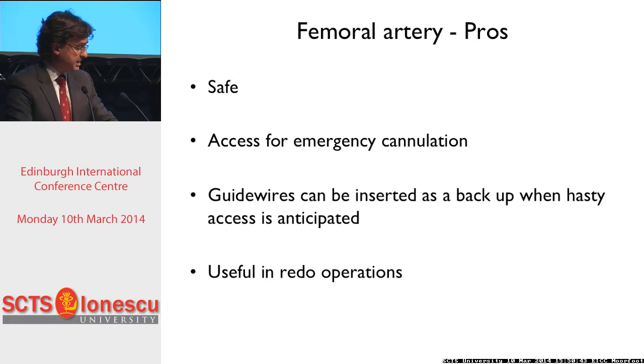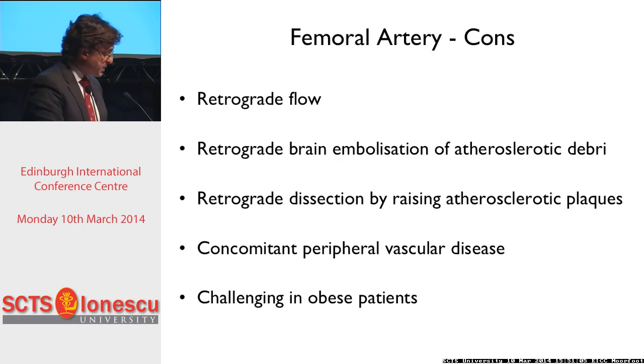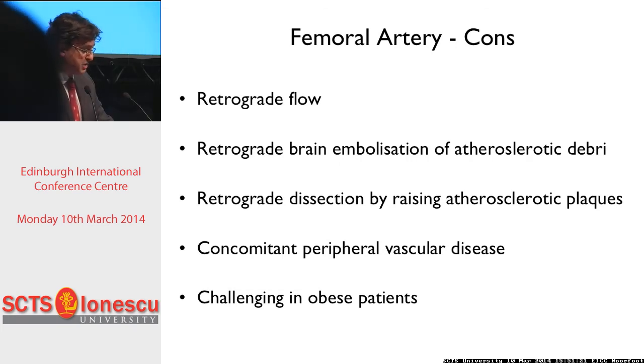Coming to the femoral artery, the advantage is that it's safe, it's accessible for emergency cannulation. You can even insert your guide wires and have it as a backup if a hasty access is anticipated, and it's very useful for redo operations. Disadvantages is the retrograde flow. Especially in atherosclerotic aortas, there is a potential of retrograde brain embolization, potential for retrograde dissection. Concomitant peripheral vascular disease makes it very challenging to impossible, and it can be very challenging in obese, maybe Texan, patients.